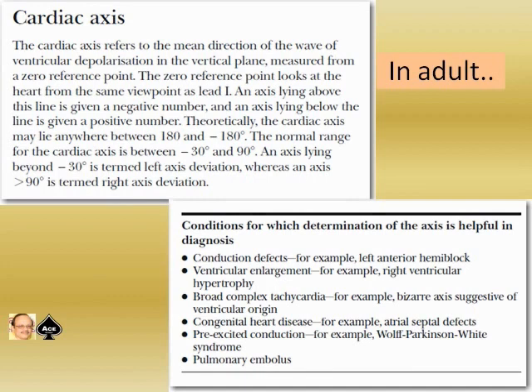And the same law appears applicable in children also, but the only thing is that according to age the axis may be physiologically normal.